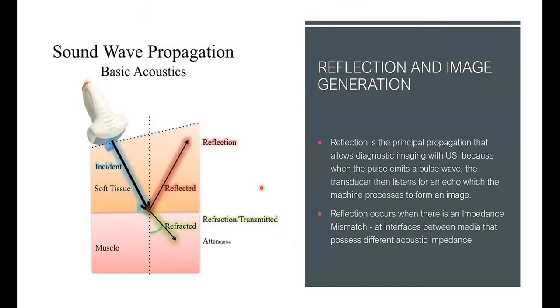Sound wave propagation is a very important aspect of being able to see deeper structures. Again, if you have bone and you put a sound wave through it, because bone will reflect the majority of your sound waves back, 99%, you're not going to be able to interrogate the deeper structures. But another very important concept is attenuation. As sound waves penetrate and go deeper, they lose energy because of absorption of these sound waves by the different tissues in that particular area.